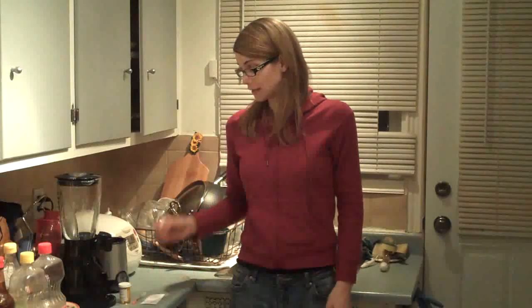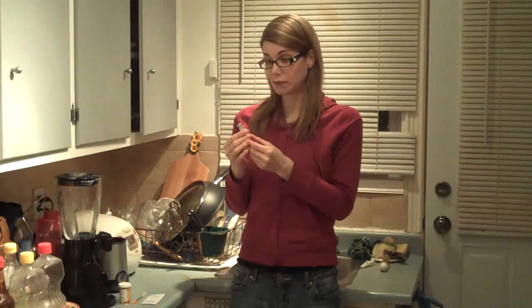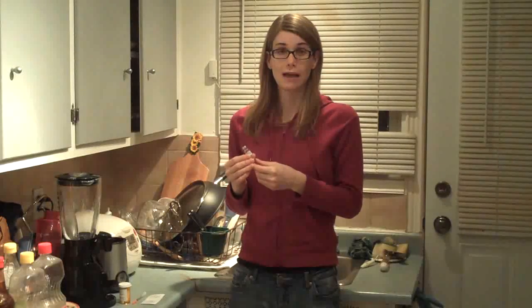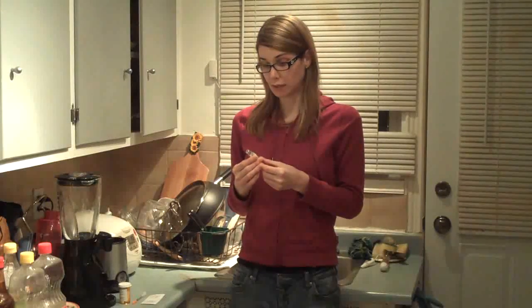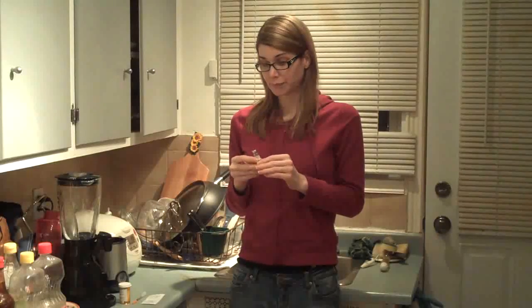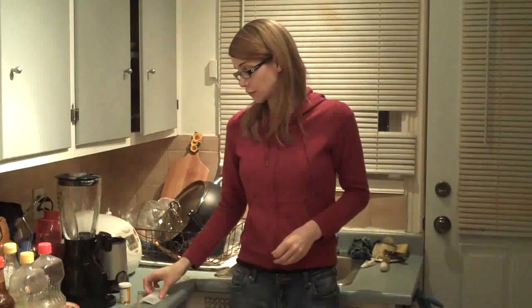So what I'm going to be using is my estrogen — estradiol valerate 20 milligrams per ml. I inject 0.2 ml of this once a week, every Monday. So today is Monday night, and a little vial like this lasts me about six months. It's meant to be sterile, so the estrogen is in here and I sterilize the vial before the injection — this is the first step.